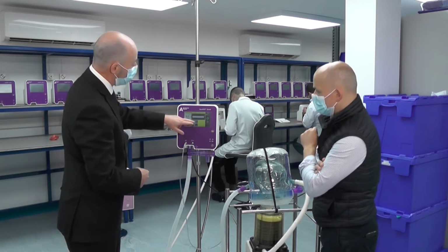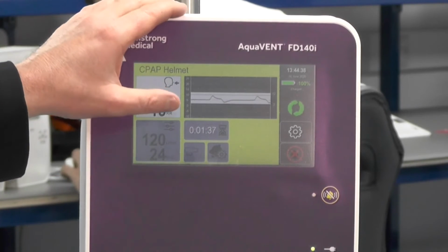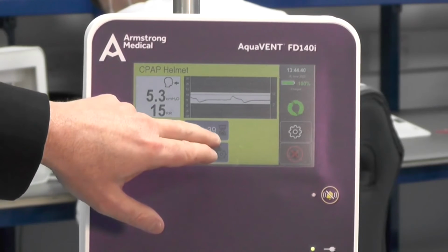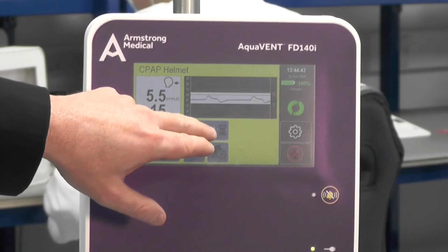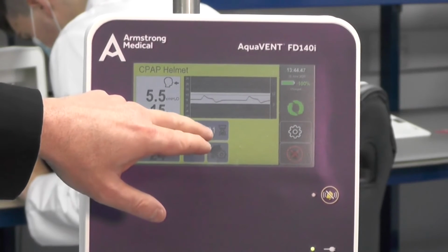The therapy is always timed from the start of the therapy. If we want to give the patient a short break from the therapy, we can pause the clock. As long as the screen is not locked at the time, you can just pause the clock and reset it.